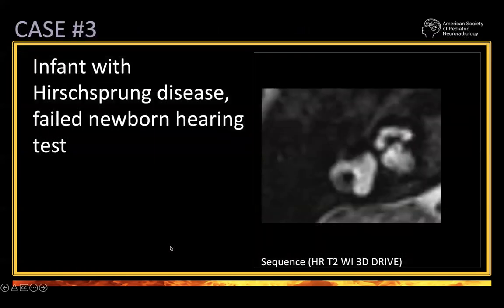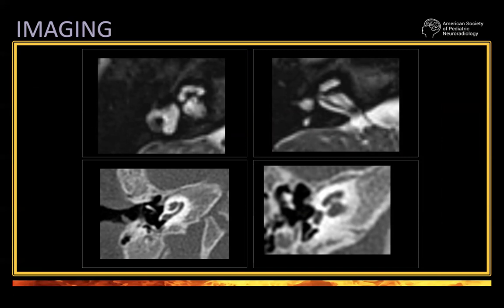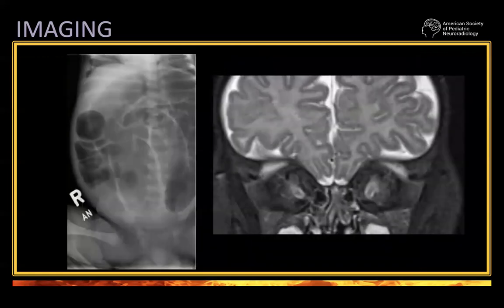Case three: this is a child with Hirschsprung disease — the abnormal dilatation of the intestine — and again, failed newborn hearing screening. Look at this cochlea on CT and MRI. Look at the characteristics of the semicircular canals — some of them are visualized here, but probably not completely normal. It's very, very important that you focus in this case on the characteristics of the cochlea and of the semicircular canals. This looks different from the cases I showed before.